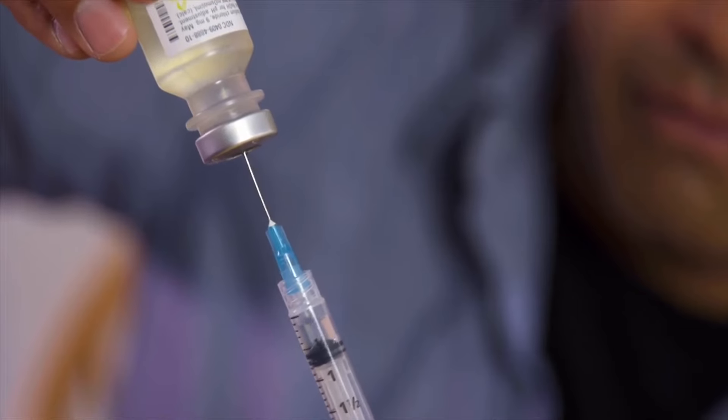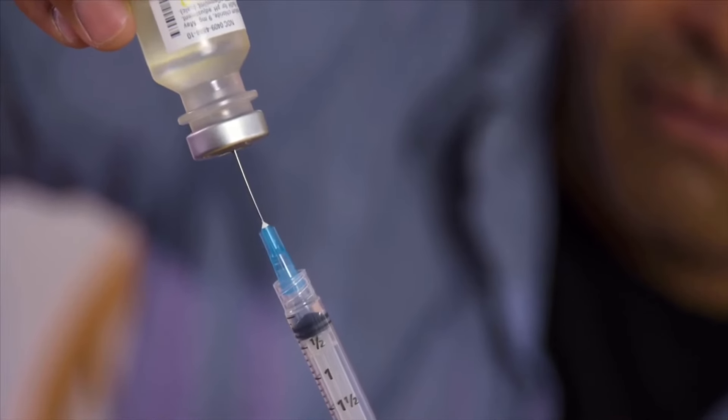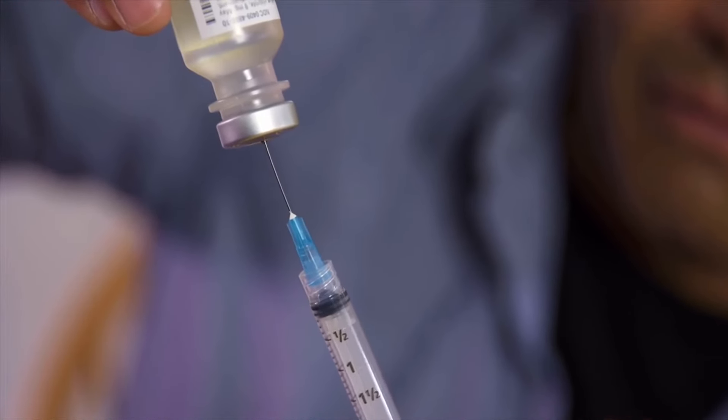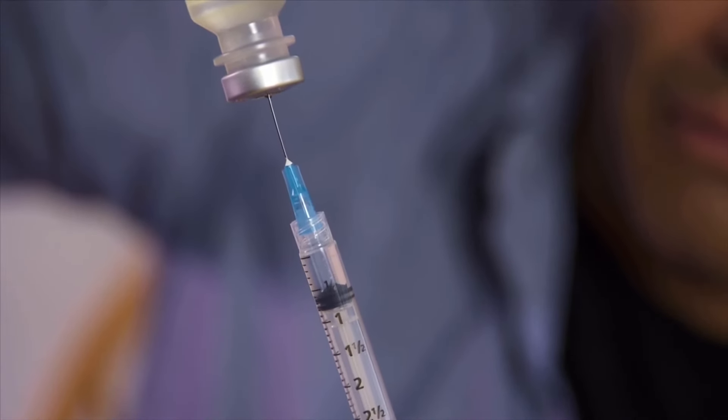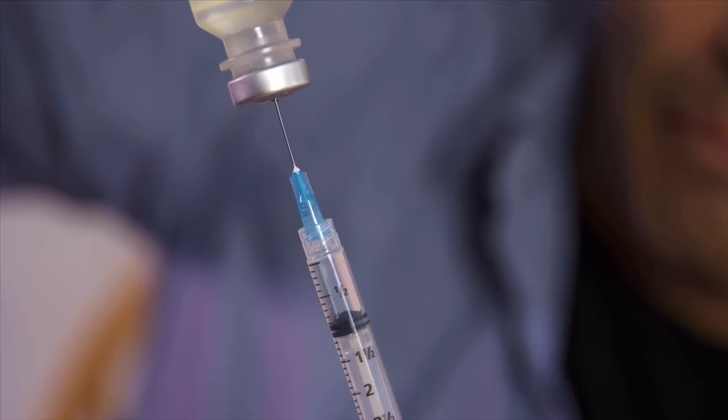If you notice any large air bubbles, you need to remove them. You do this by pushing the plunger in again, sending the medicine back into the vial. Then you slowly draw the correct amount out once more.